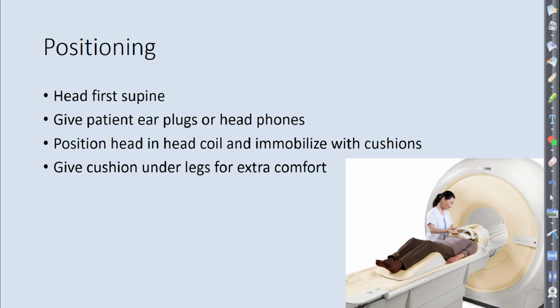Yeah. Try and find like a more external structure. If you have a tumor of the pons, where do you center the pons? No, try and find something that you can actually locate on the exterior. So you always want to kind of have isocenter right there because that's going to give you your best fat saturation if you do have to fat sat, and your best homogeneity.